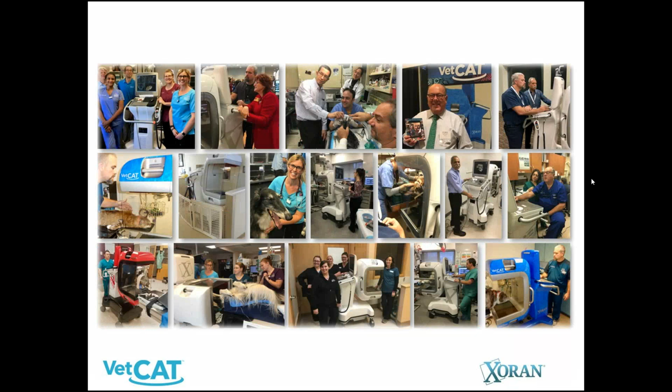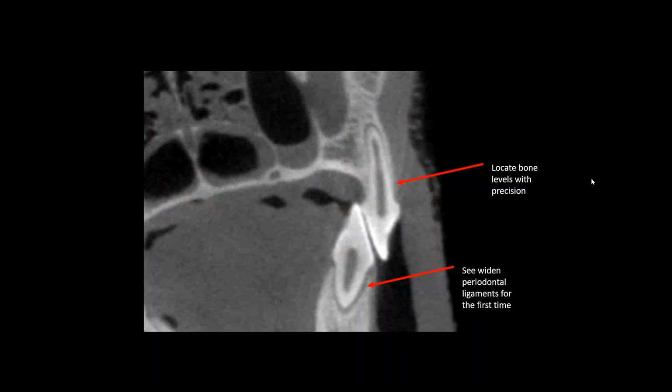VetCAT has now proliferated around the country nationally. We have VetCAT scanners from the East Coast to the West Coast, and a great experience throughout various clinics, smaller and bigger. And there have been a few thousand patients now treated using VetCAT.